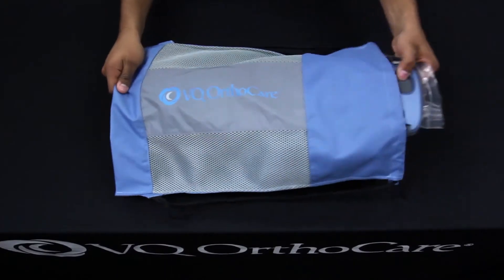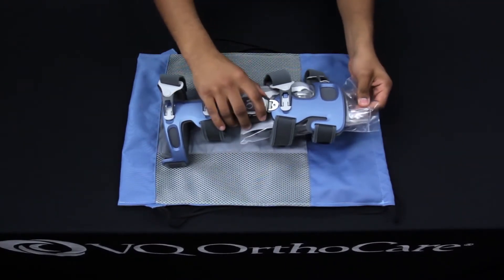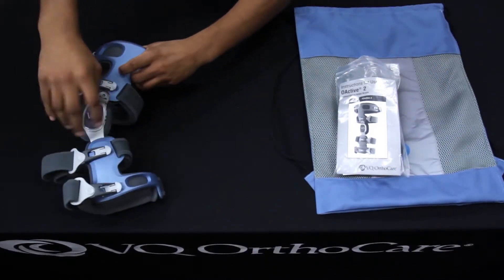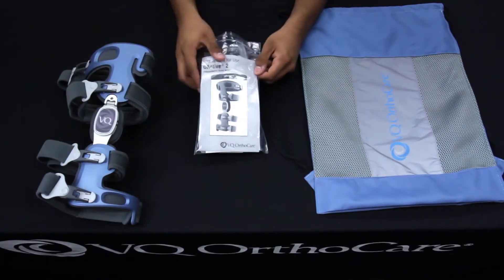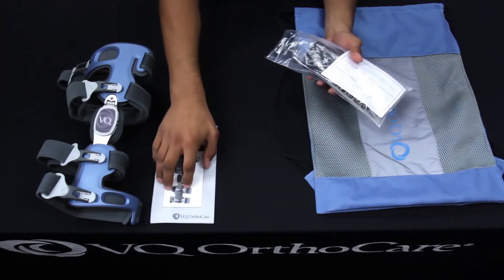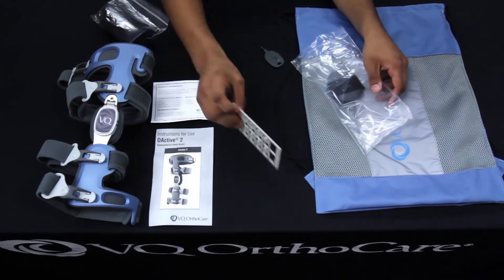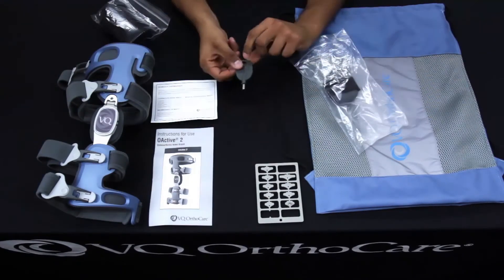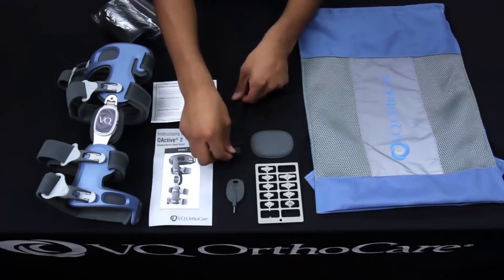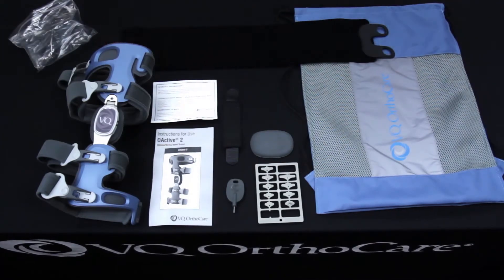In the brace bag you will find the O-Active II brace and a plastic accessories bag. In the plastic bag is the instructions for use, the warranty card, the flexion and extension stops, the patient adjustment tool, extra condyle pad, an elastic strap extender, and the suspension wrap.